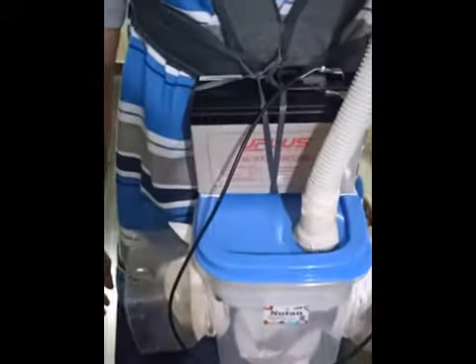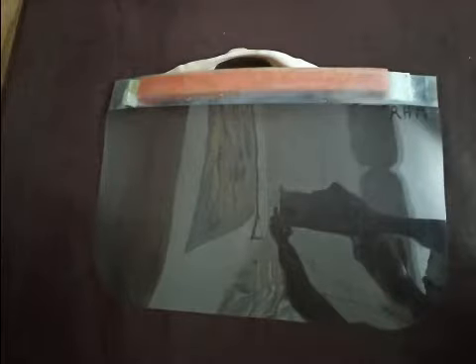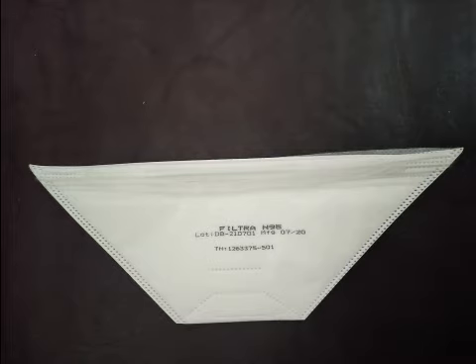Actually, it was a treat for myself after doing some difficult image handling software for one hospital. Here I have used a large plastic bag, took a face shield and fixed the face shield inside the plastic bag. I used three duckbill N95 masks and fixed them on plastic bottles.